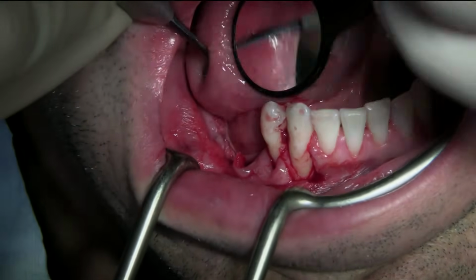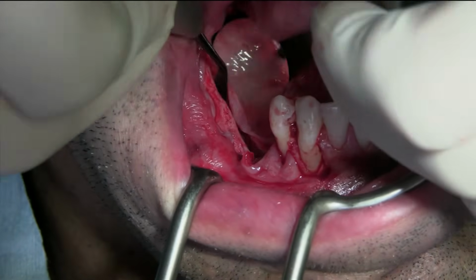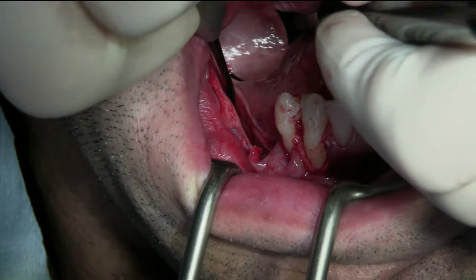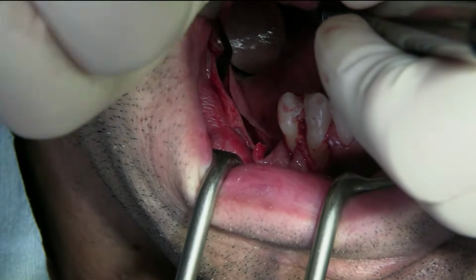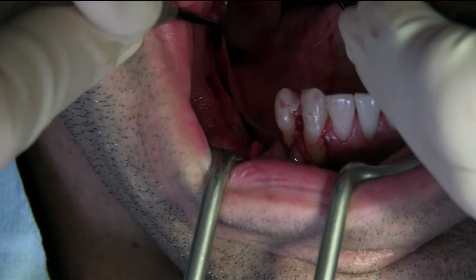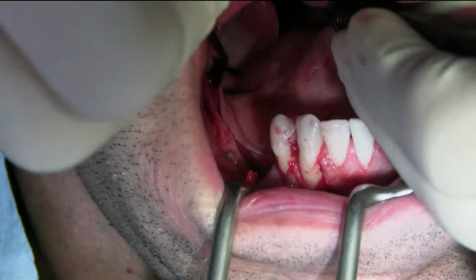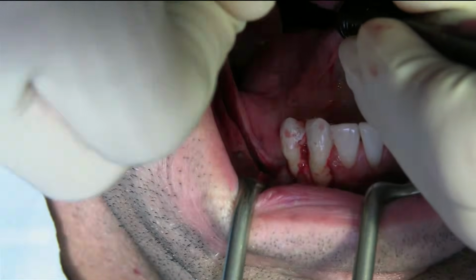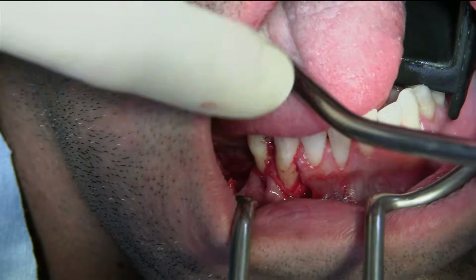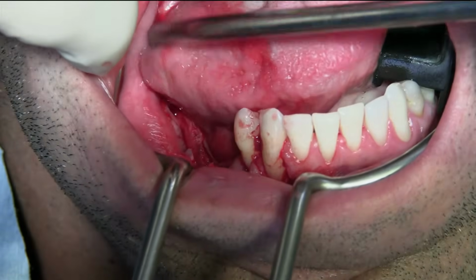Difficult to feel a little bit? Okay, remove some more anesthetic. Okay, we got pretty much a big part done.